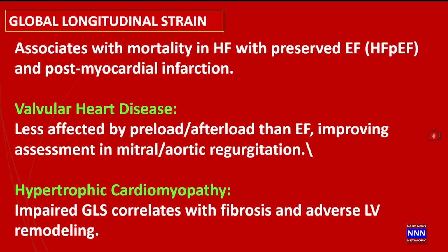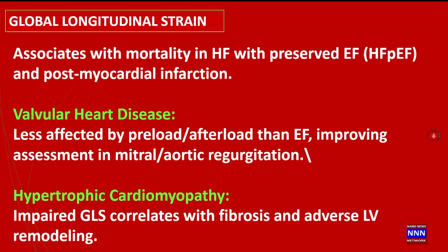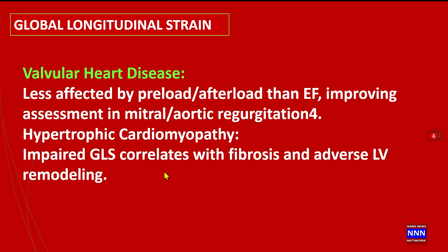Of course, in patients with hypertrophic cardiomyopathy, because of the disruption of the myocardial fibers and fibrosis, we may see varying degrees of patchy areas where there may be reduced global longitudinal strain. Valvular heart disease, we already talked about this.